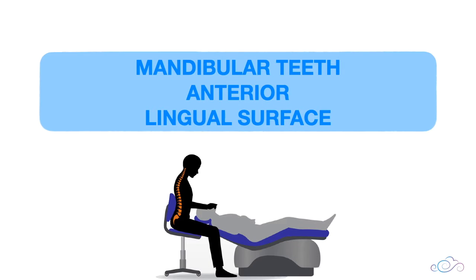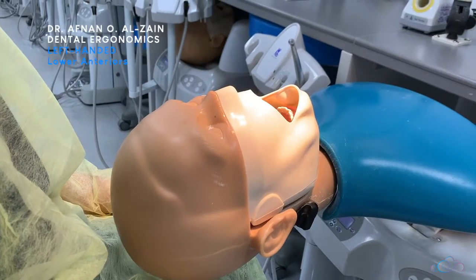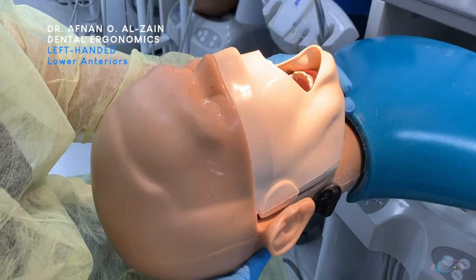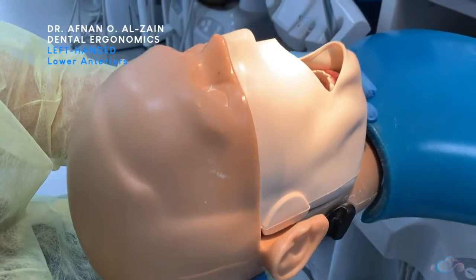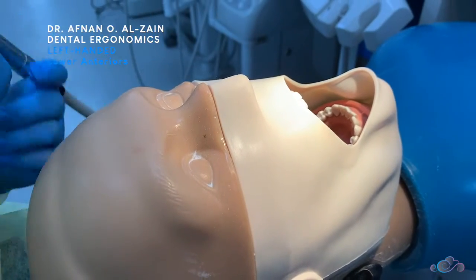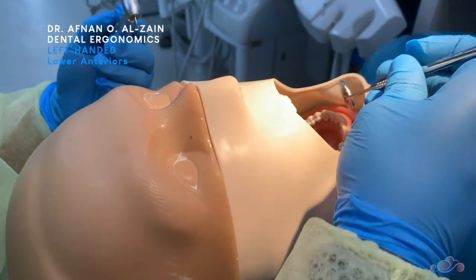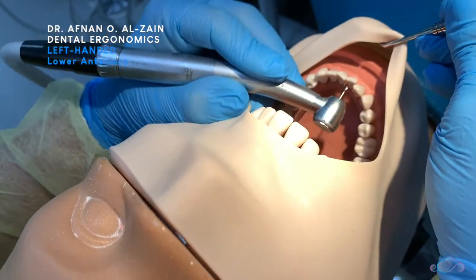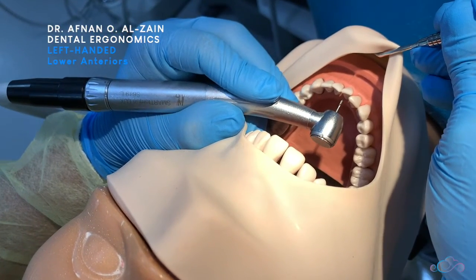Moving on to the lingual surfaces of the mandibular anterior teeth. To work on these surfaces, you're going to tilt the patient position upwards just a little bit so you can see clearly, then place the burr perpendicular to the surface with finger support. You can use the mirror either to reflect the light or retract the soft tissue.